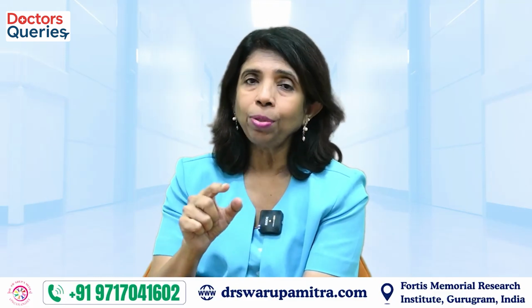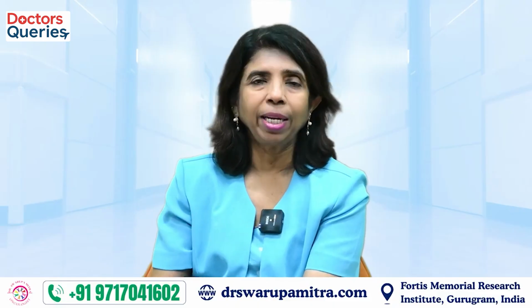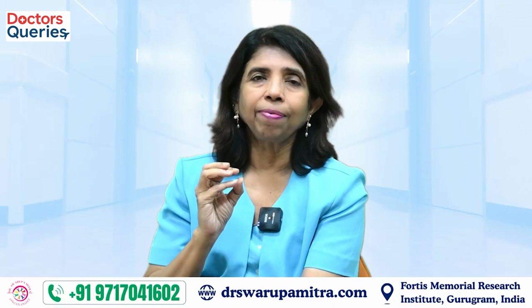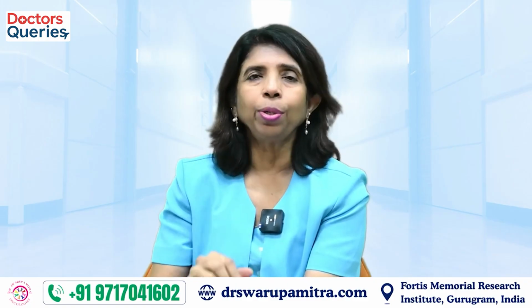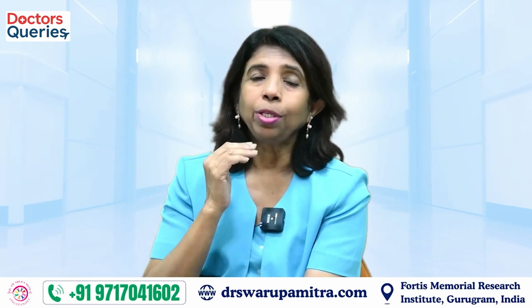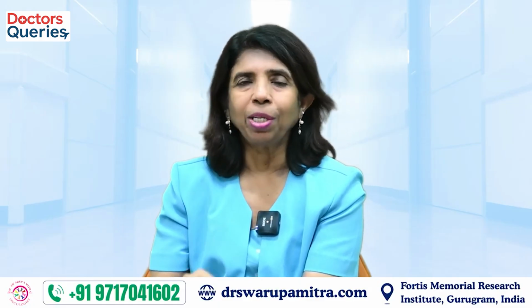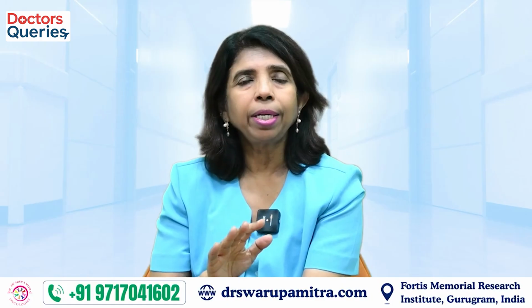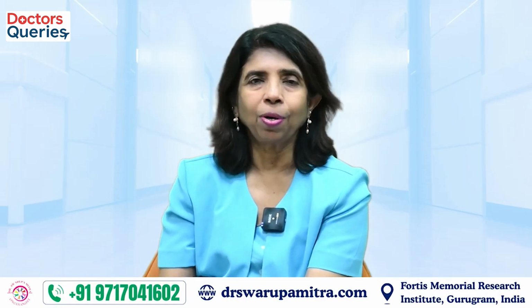Also, when we reduce the side effects and protect the normal areas, then we can deliver a higher dose to the target areas. And in doing so, the chances of cure are much better, the toxicity is less, and the quality of life of the patient is much better. Fortunately, we have all these methods in our country in most of the hospitals.